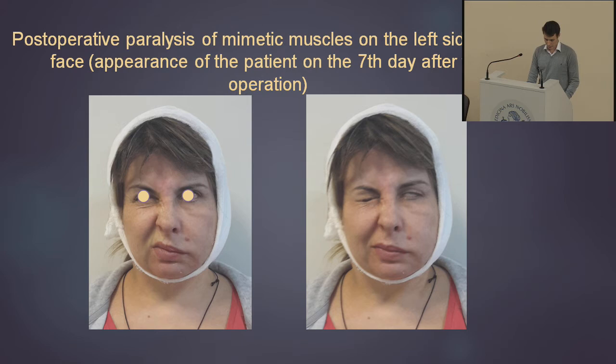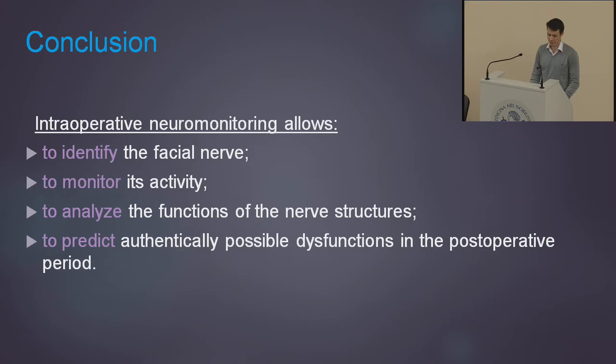In conclusion, intraoperative neuromonitoring allows us to identify the facial nerve, to monitor its activity, to analyze the functions of nerve structures, and to predict authentically possible dysfunctions in the postoperative period. Thank you for your attention.